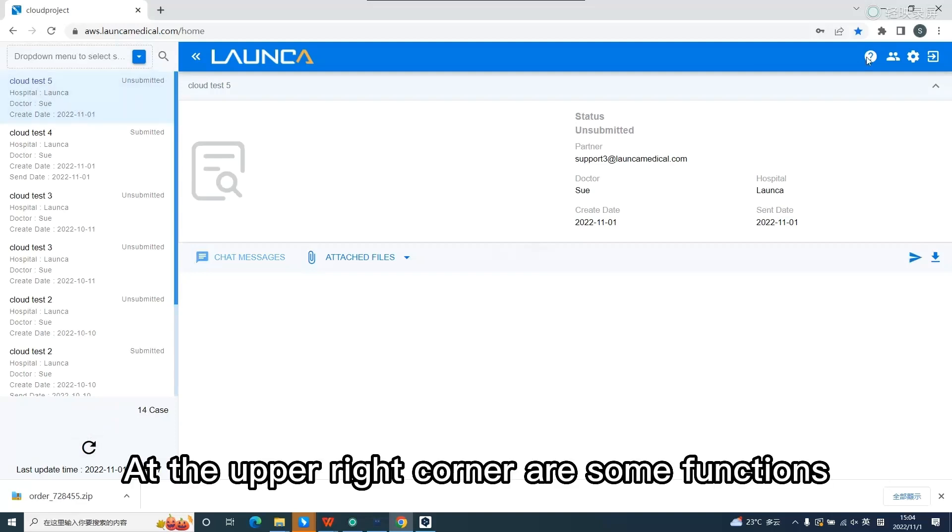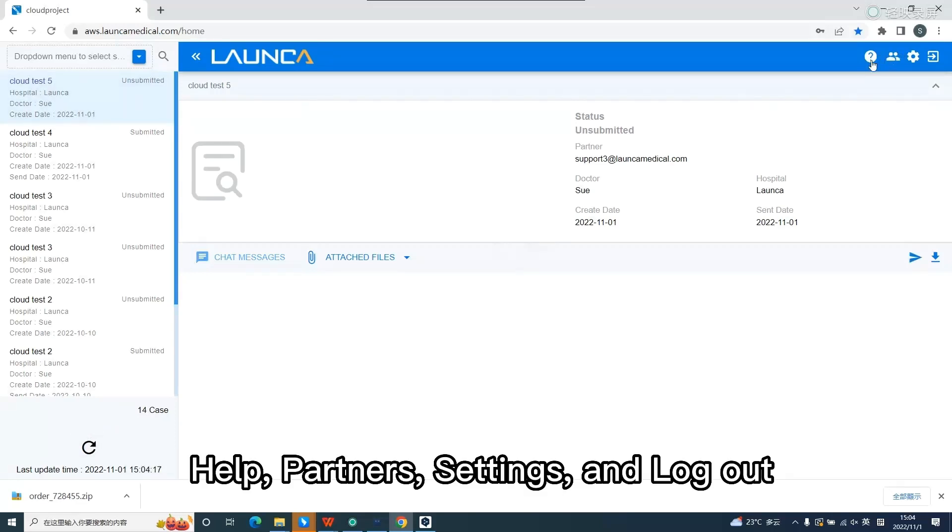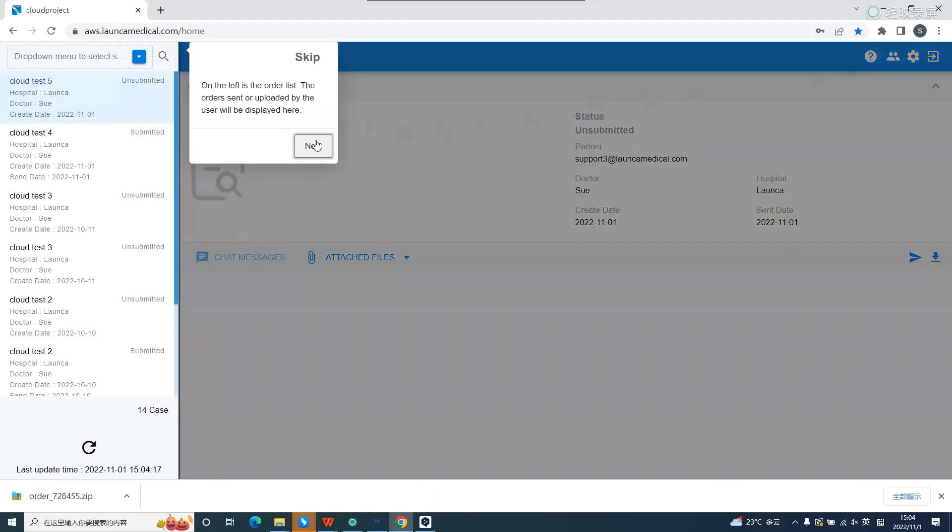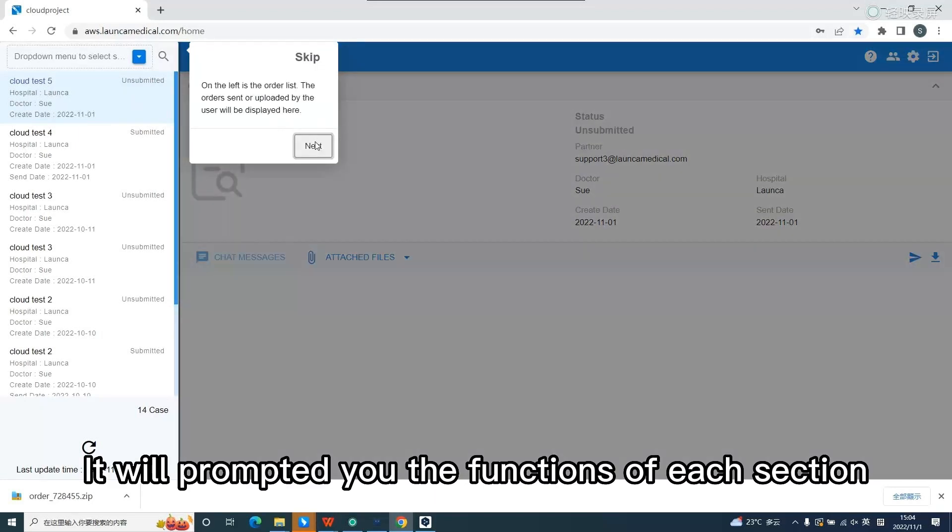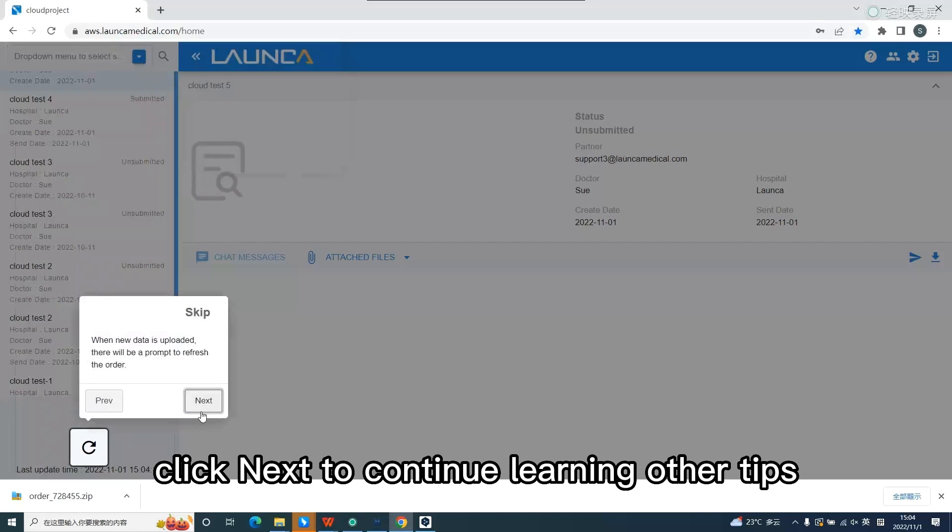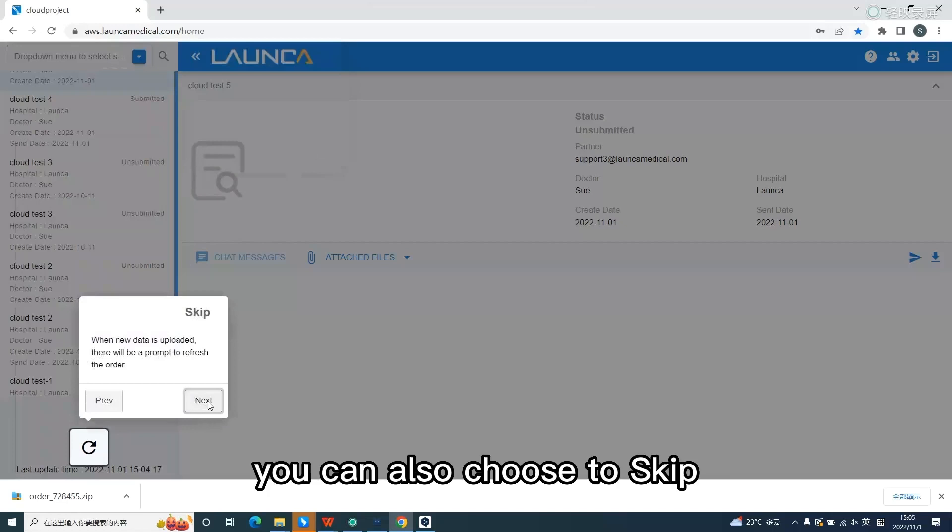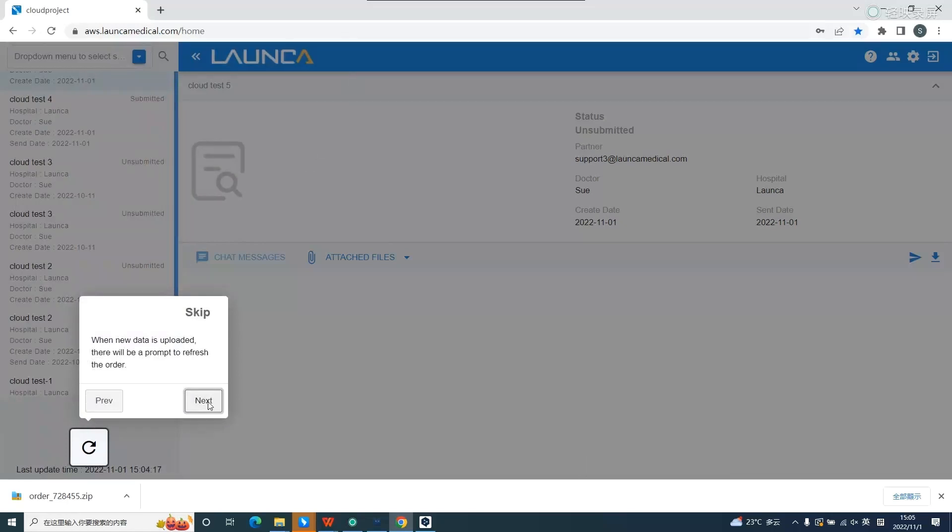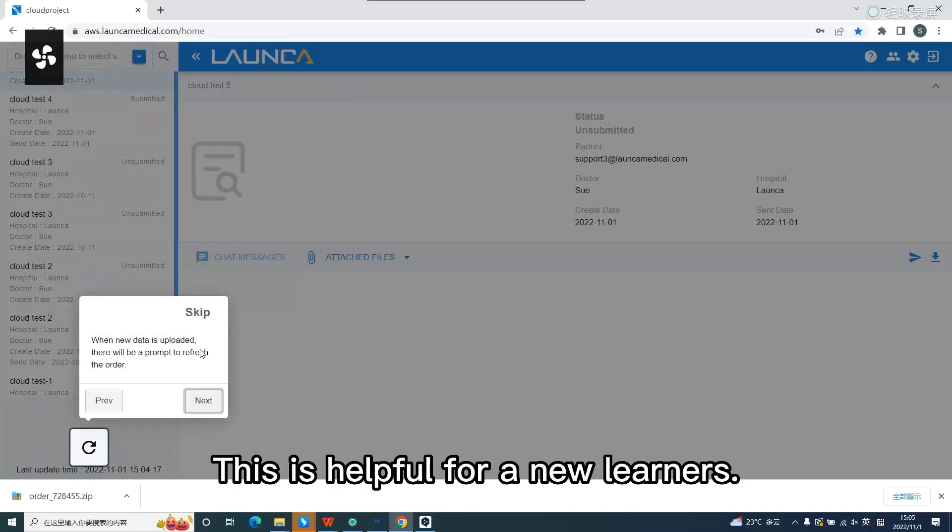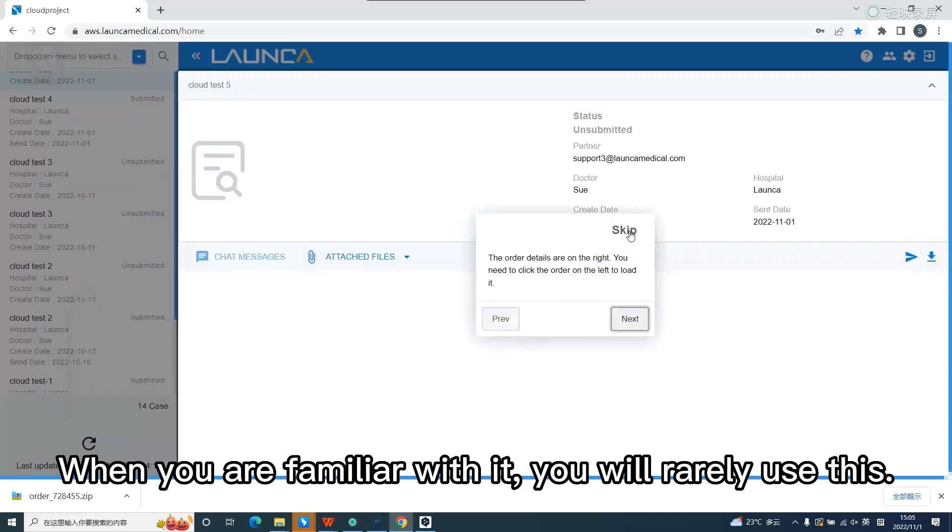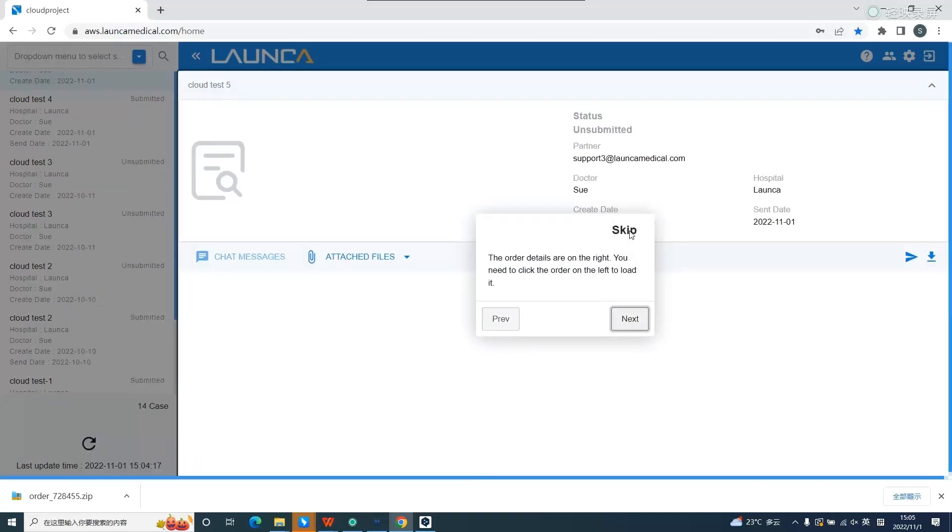At the upper right corner are some functions: help, partners, settings, and logout. Click help. It will prompt you the functions of each section. Click next to continue learning other tips. You can also choose to skip. This is helpful for a new learner. When you are familiar with it, you will rarely use this.